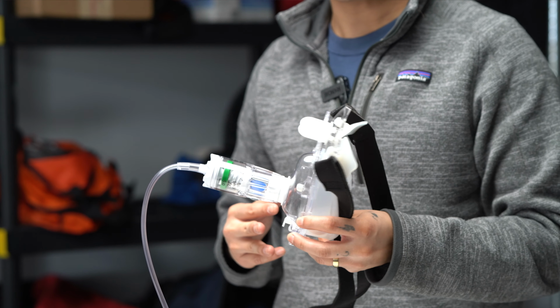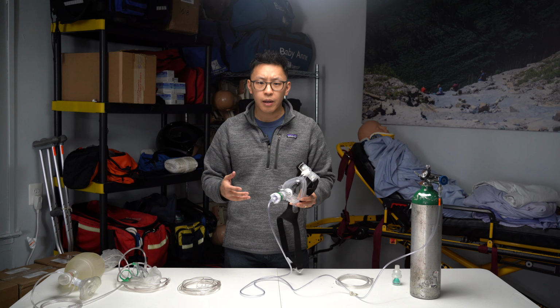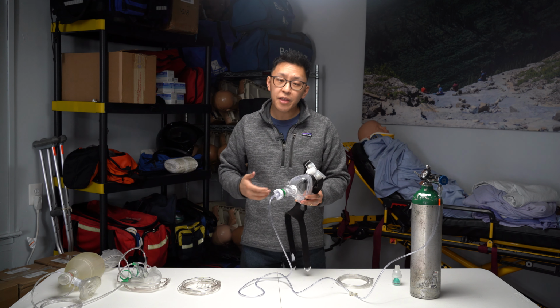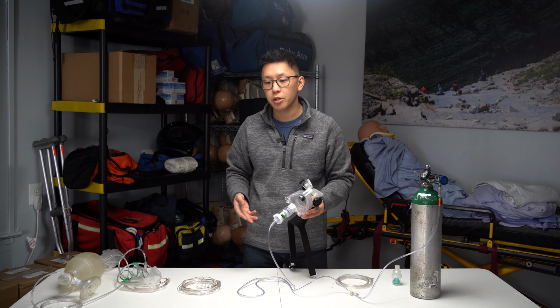And now some of the things that we need our patient to be before we just apply CPAP: they need to be alert and oriented x4. They have to be able to maintain their airway. And then they need a systolic of at least 90. We say 90 millimeters of mercury because that's the national standard for hypotension.